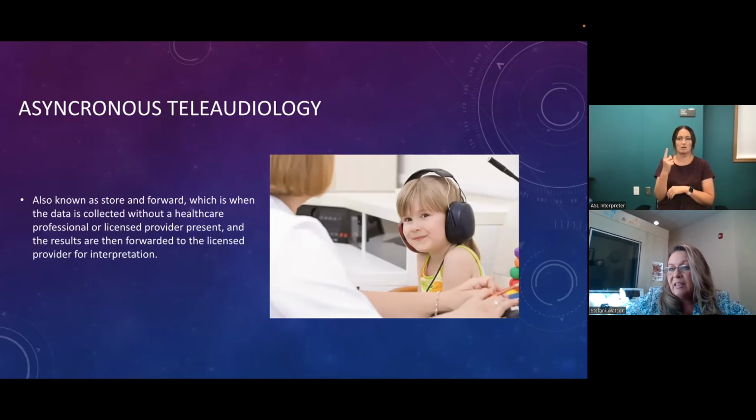Now, if I fit the hearing aids and do the first fit on a pair, then I can do that through Oticon or Phonak. Both have something called remote care, and I can change the settings on the hearing aid through the computer, or with a phone app that they download and connect by Bluetooth to the child's hearing aids. We do that with parents' permission only, of course. So our audiologist doesn't have the capability of ordering hearing aids or molds or anything like that anymore.